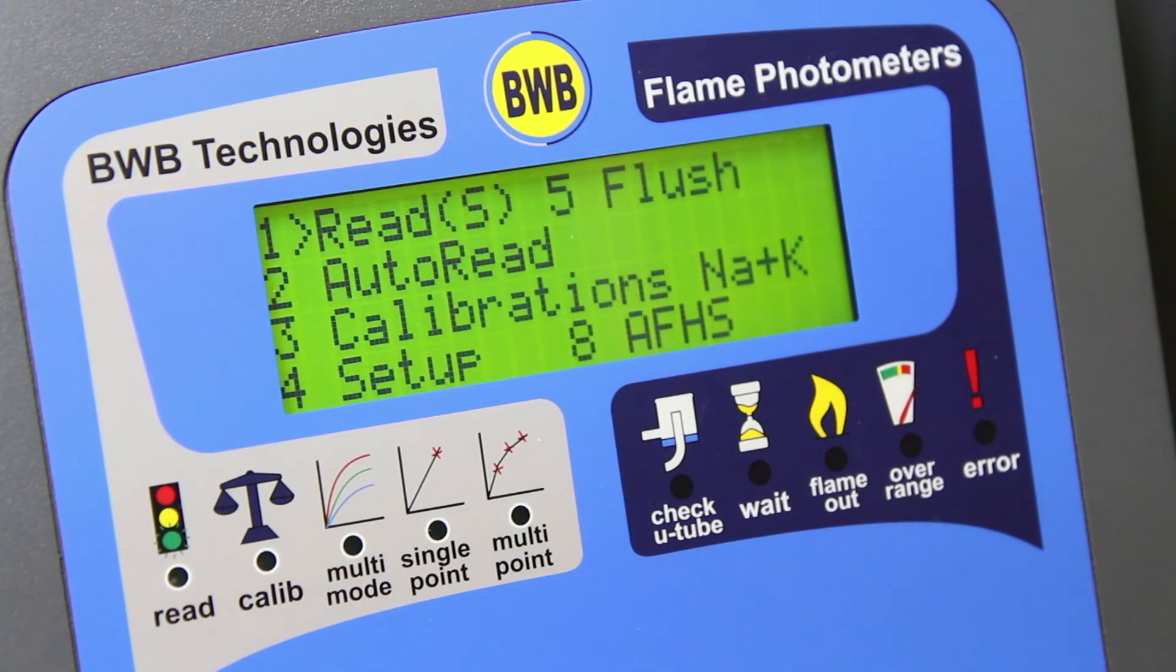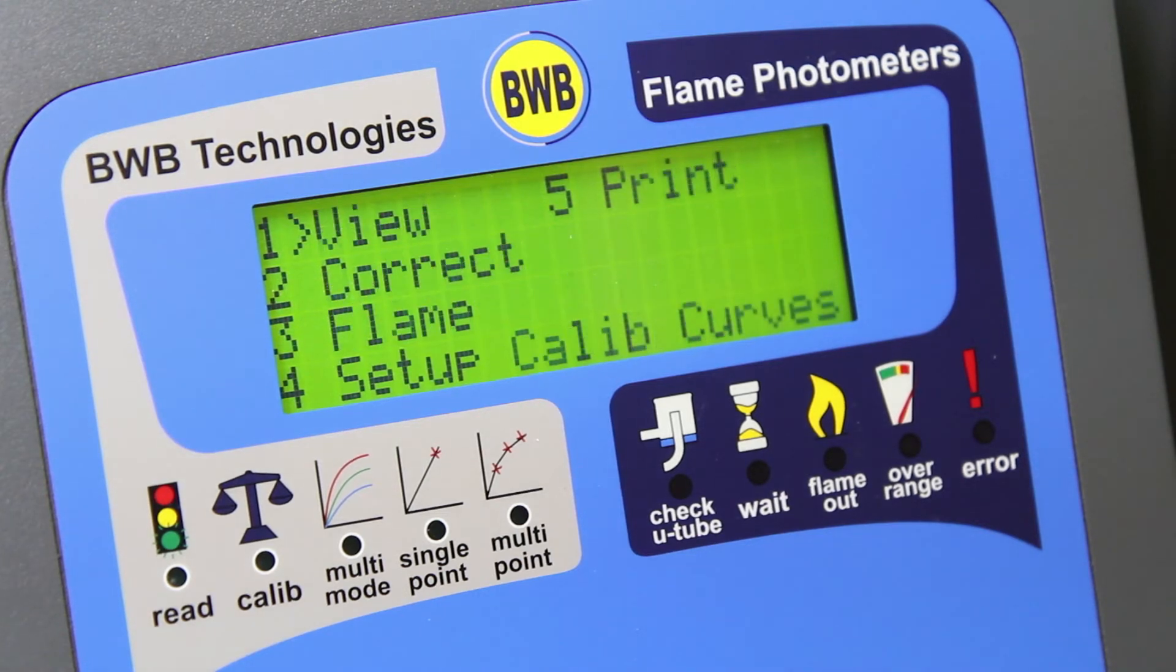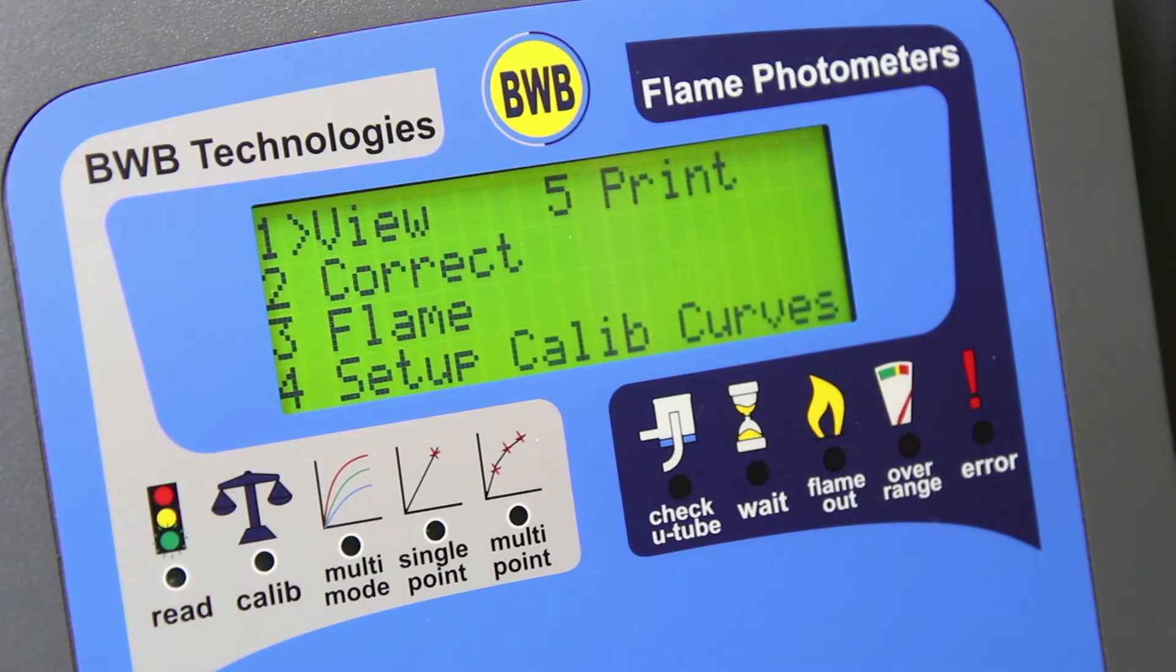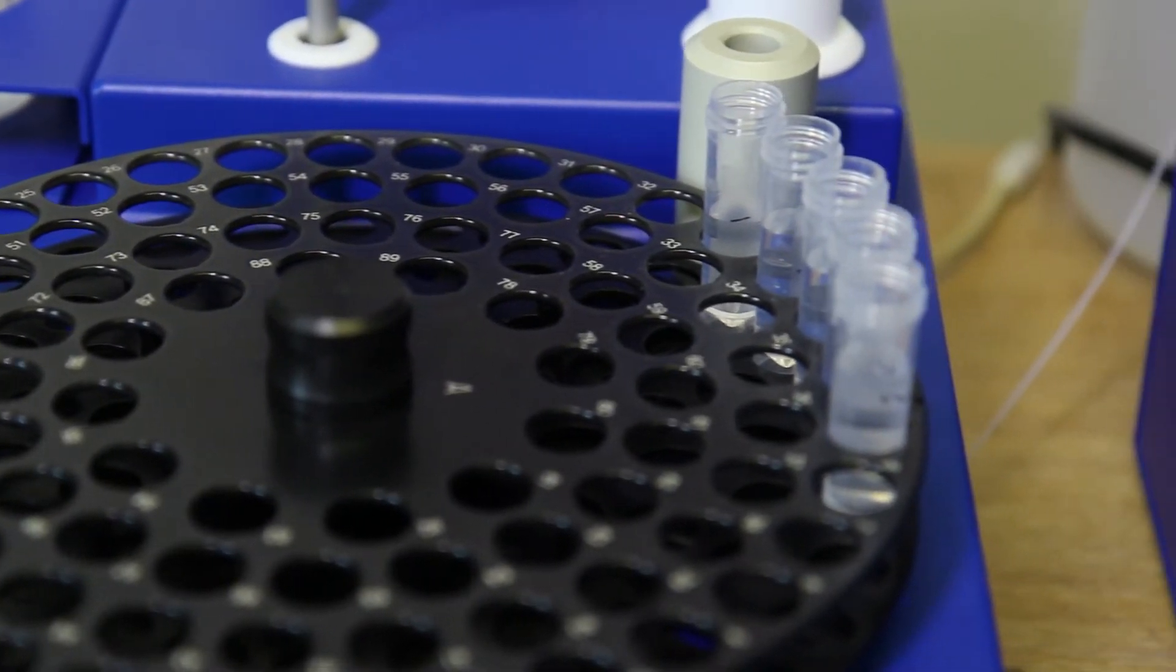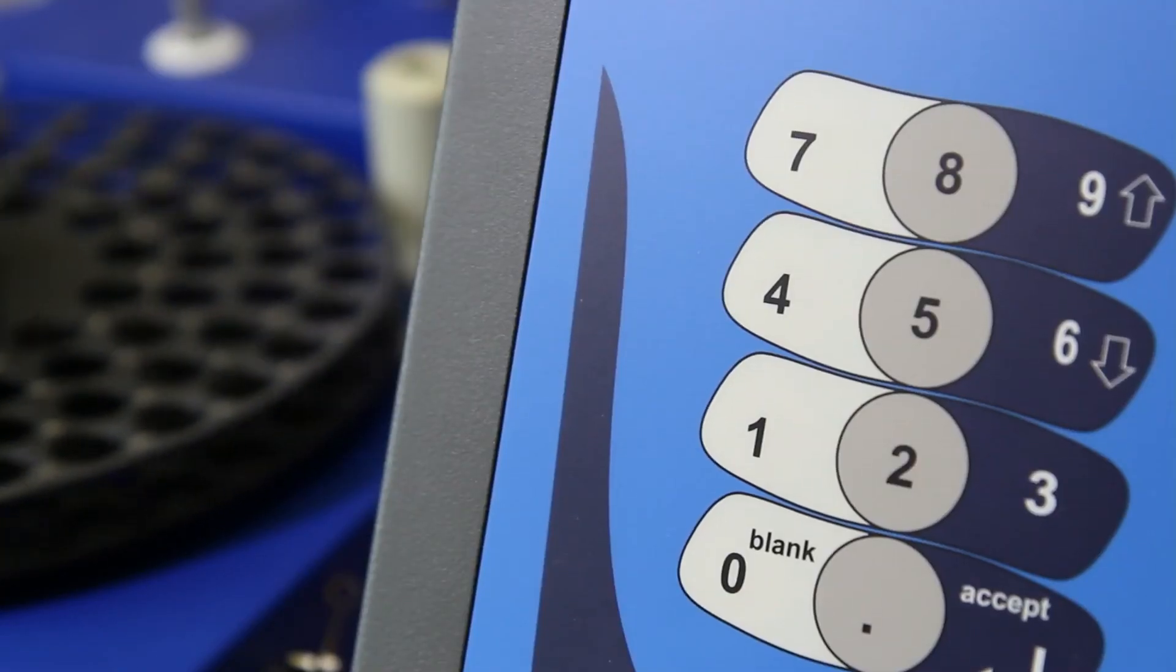The option of setting up the calibration curves is then available. Select calibrations, set up calib curves and press accept to begin the automated calibration process. The process takes approximately 20 minutes to complete.